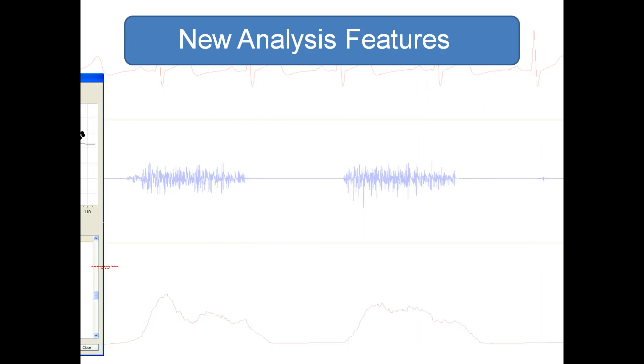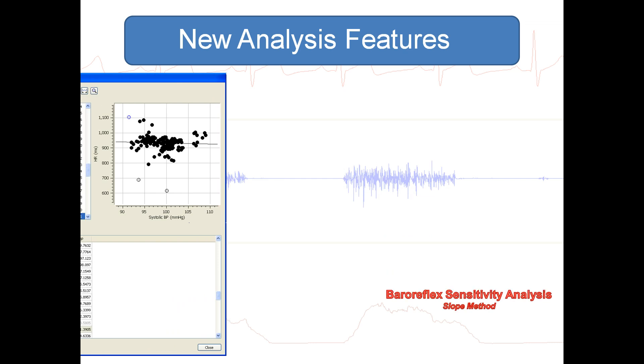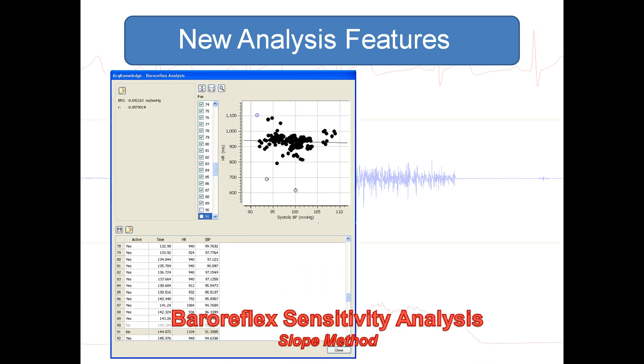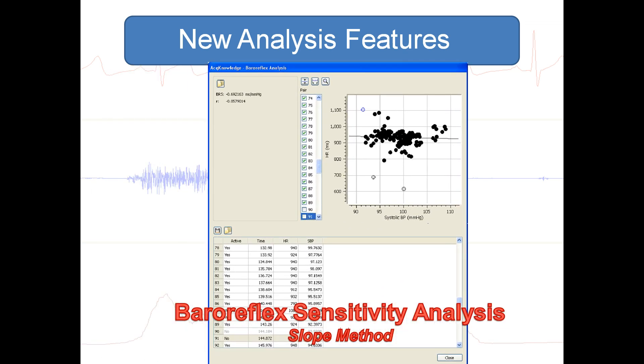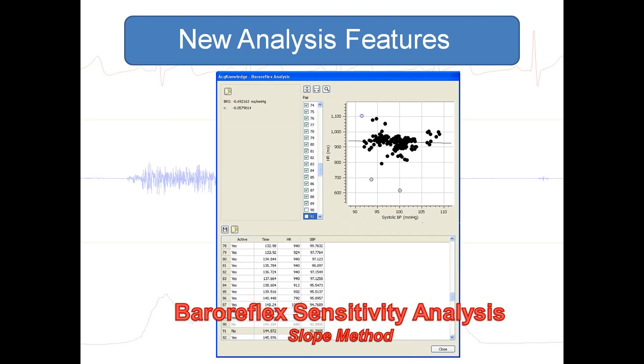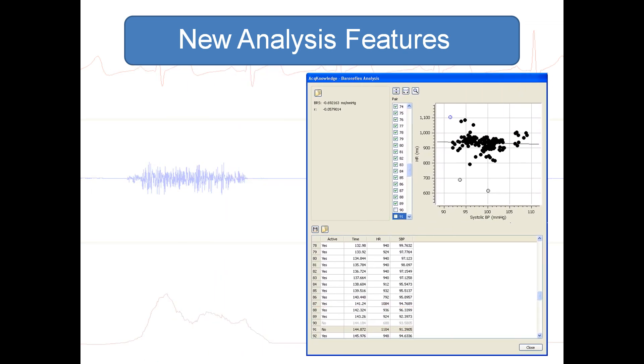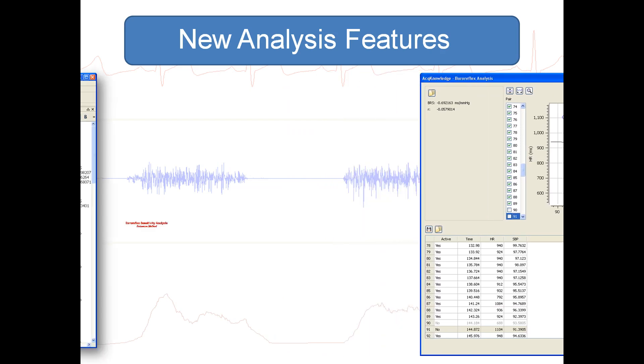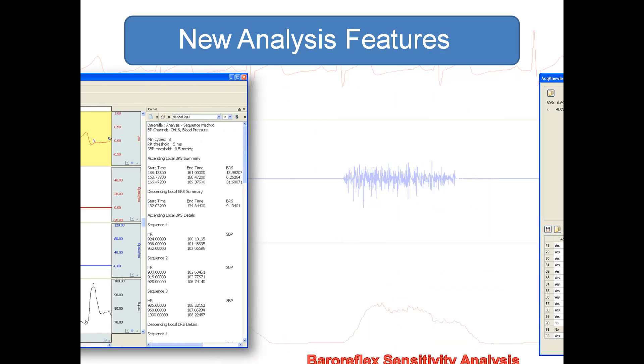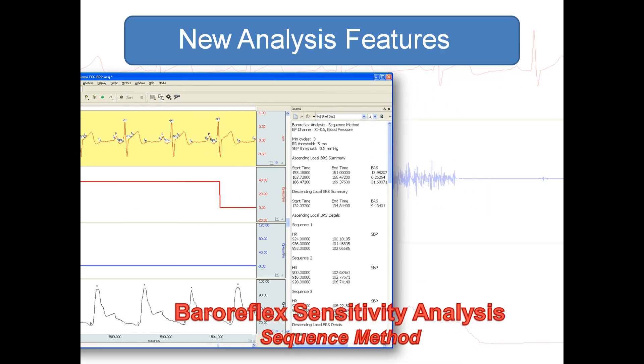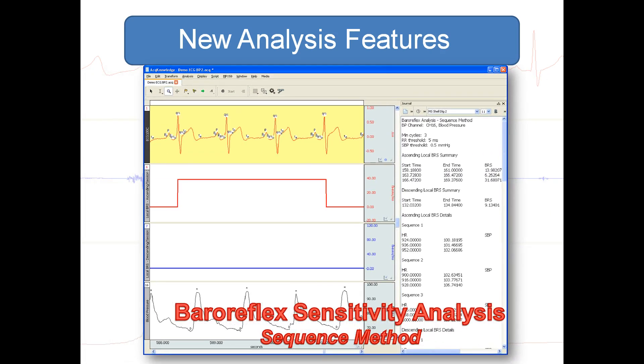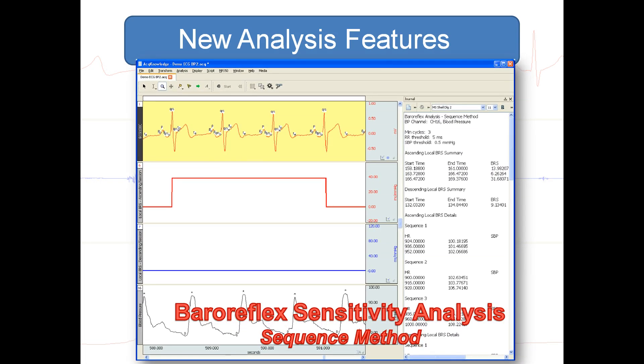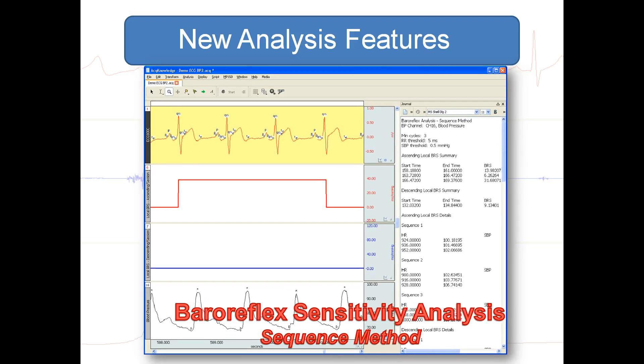Baroreceptor reflex sensitivity analysis using the slope method or the sequence method can be calculated from an ECG and continuous blood pressure signal.